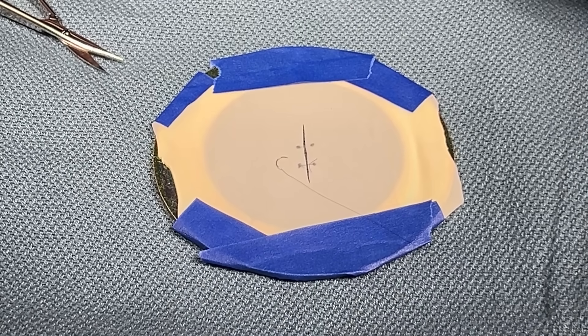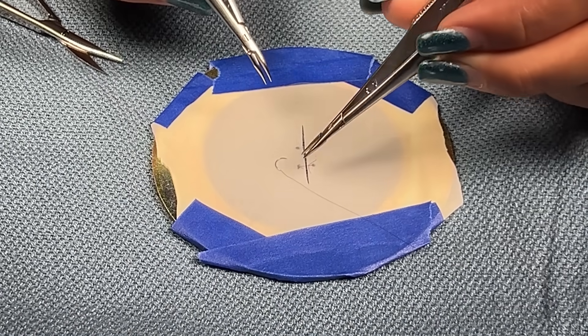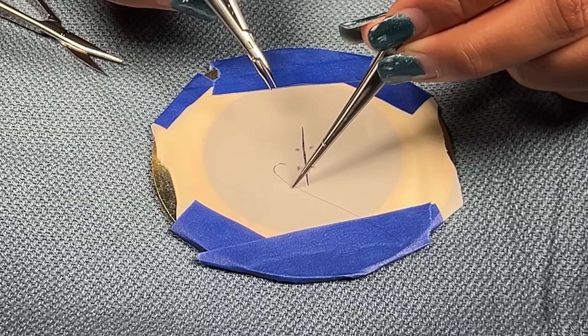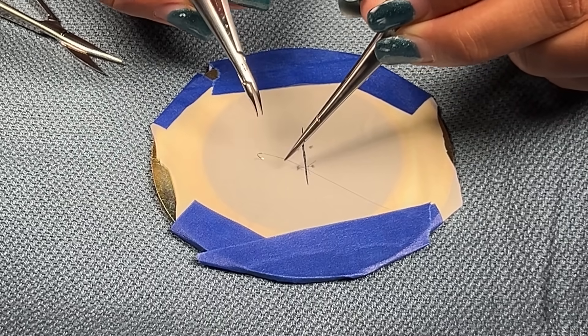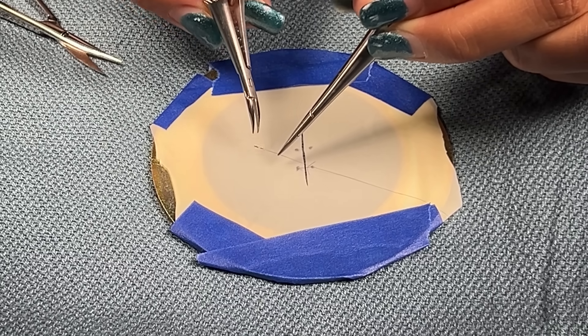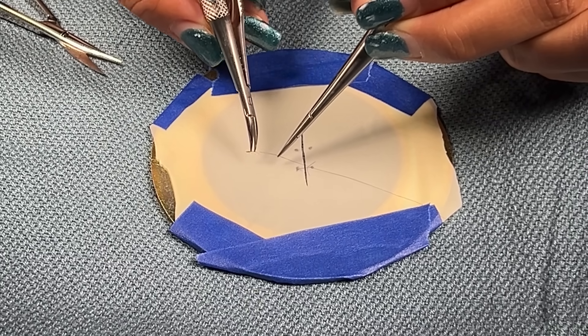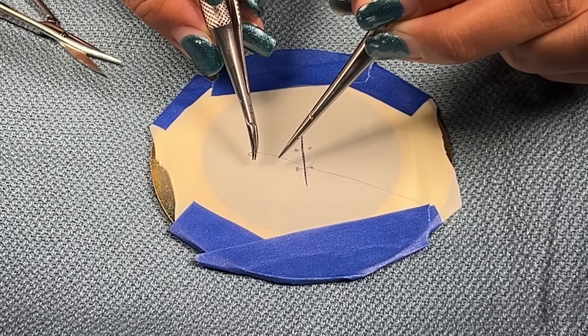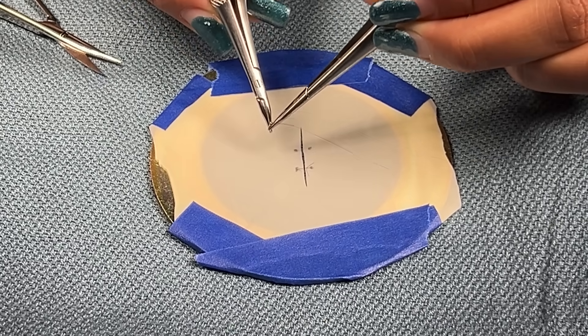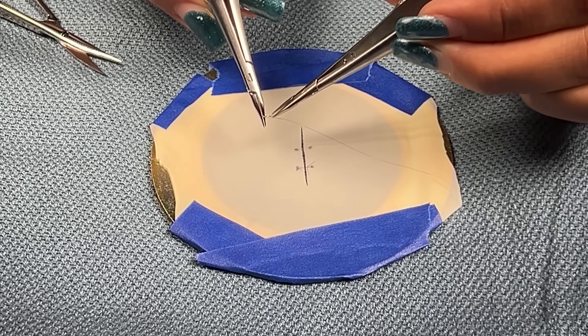I'm going to start by stabilizing the needle by grabbing the suture with my forcep and using my driver, I'm going to grab three-fourths away from the tip of the needle and also perpendicular to the needle.